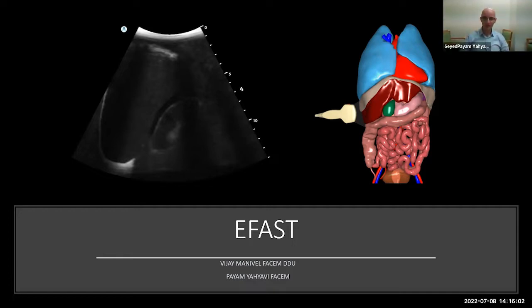Hi, this is Payam, one of the emergency physicians. I used to work at Nepean Hospital with VJ, the emergency physician there, as the ultrasound fellow. These days I'm working at Concord Hospital, and I'm doing my emergency DDU. So today we are going to talk about the ultrasound in trauma, so mainly covering EFAST.